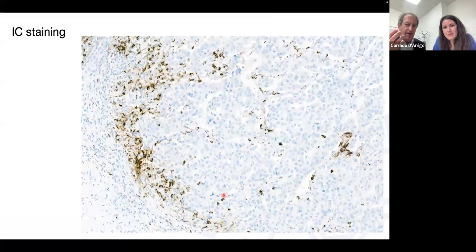As I said, it's really nice. It's really contrasted. There are no half tones. So these are really positive cells. Here it looks like an infiltrate that is just at the periphery of the tumor with a little bit of percolation inside, but almost excluded. And you can recognize two cell types here. The dots are most likely lymphocytes, and they're quite dark. And then the dirty, granular ones are probably macrophages.